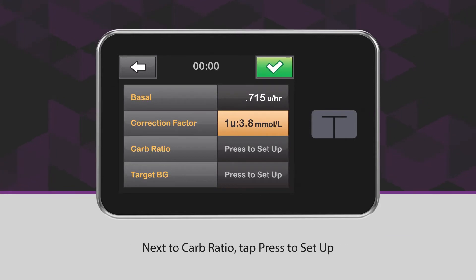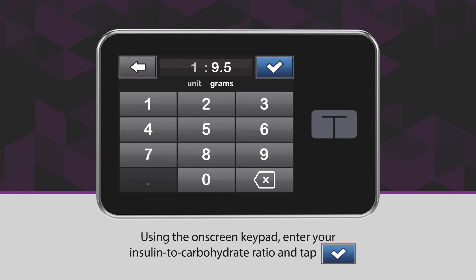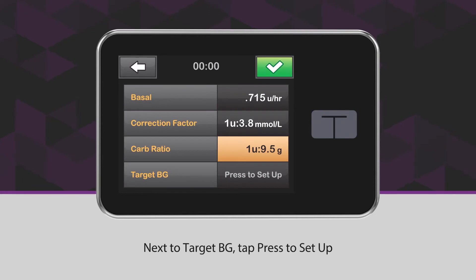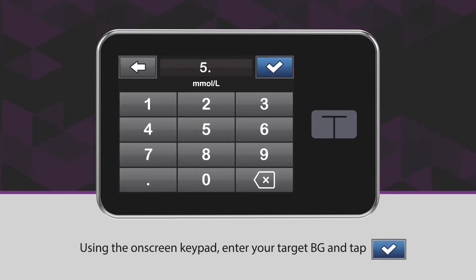Next to Carb Ratio, tap Press to Set Up. Using the on-screen keypad, enter your insulin to carbohydrate ratio and tap the blue checkmark icon. Next to Target BG, tap Press to Set Up. Using the on-screen keypad, enter your target BG and tap the blue checkmark icon.